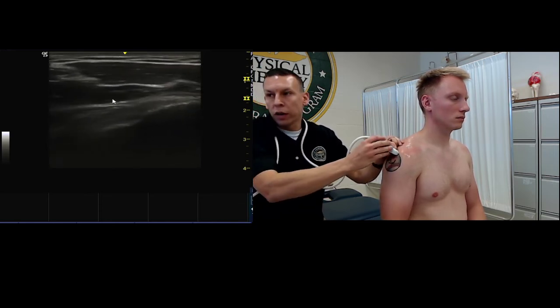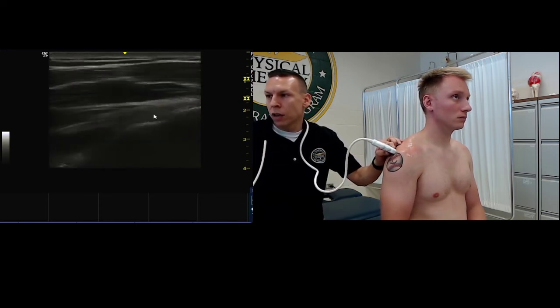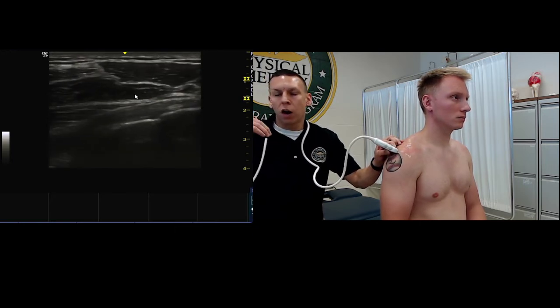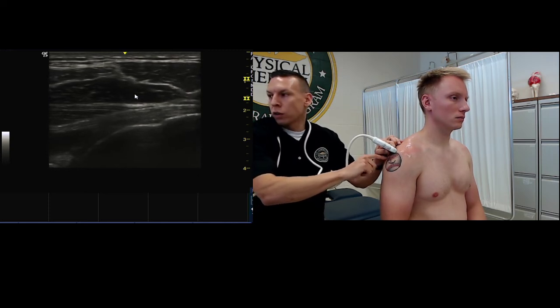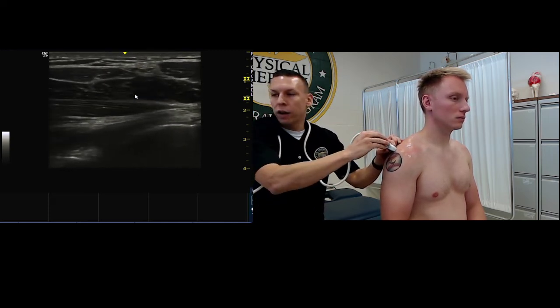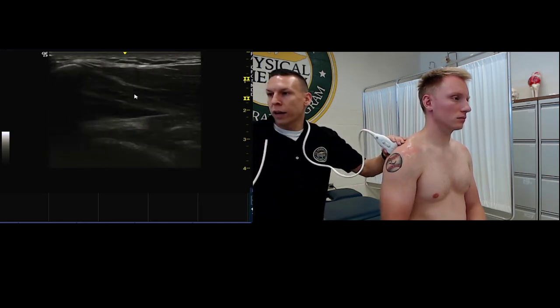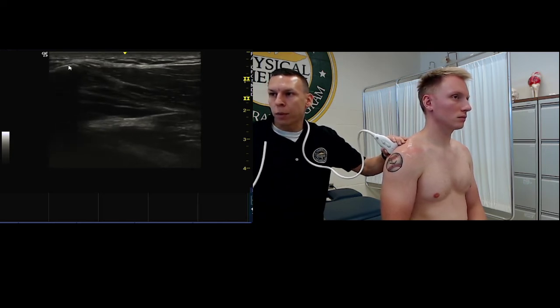We also want to look at it if you're having a hard time finding this aponeurosis or finding where the infraspinatus is. Oftentimes what I find is people are a little too caudal and they're trying to scan down here, and they need to move higher up. But an easy way to find it is to take your probe and position it. We'll look at it in short axis. You can do this first. And here's where the scapular spine is.